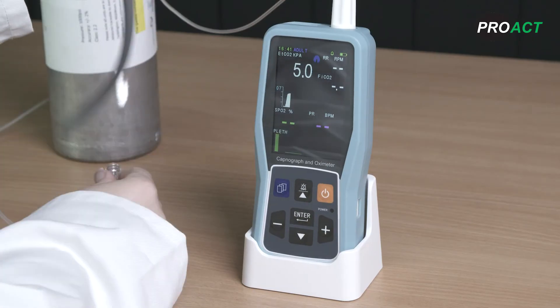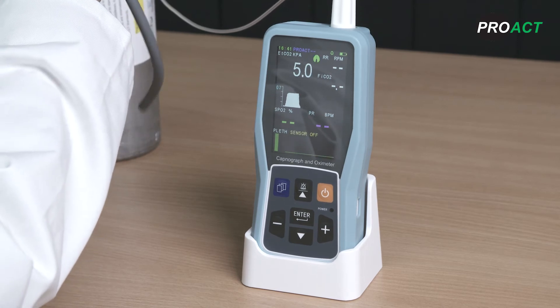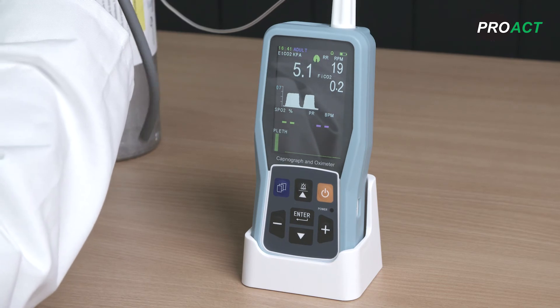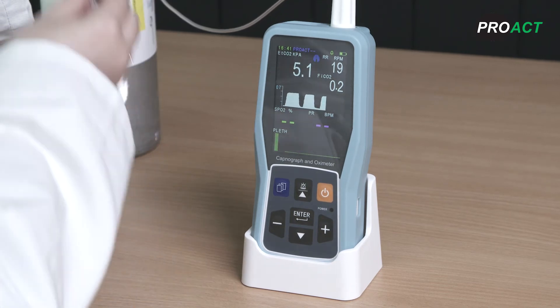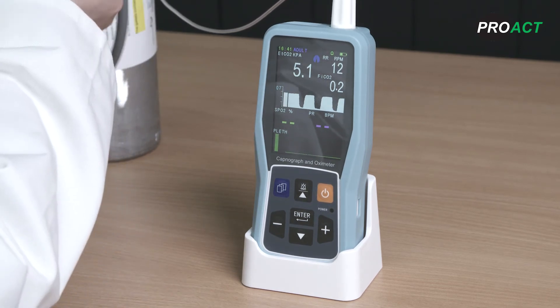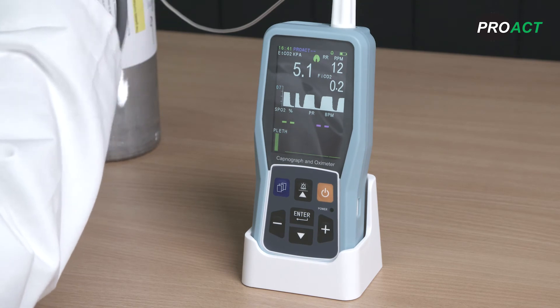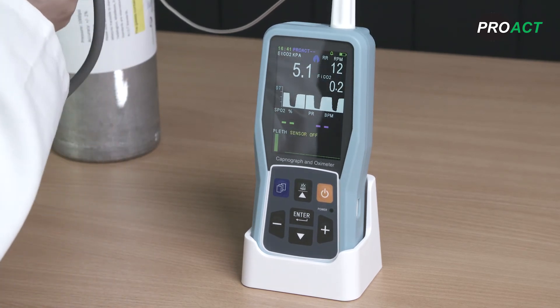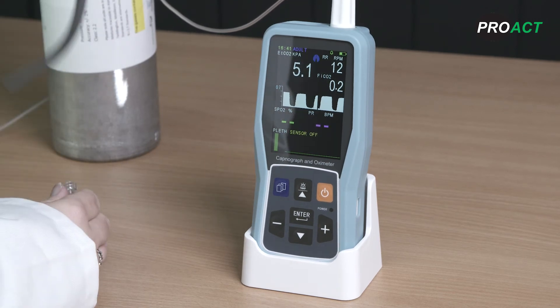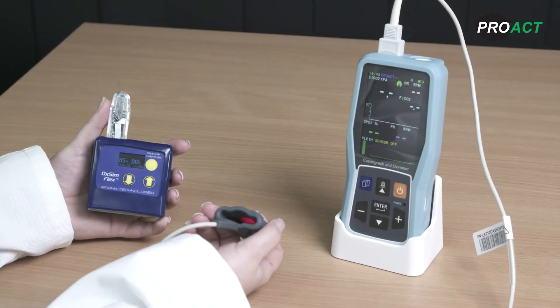Your device should read 5% CO2 plus or minus 0.2. Switch off your calibration gas flow. Should the PC-900B not calibrate correctly, repeat the procedure after checking that the gas canister isn't becoming empty. If so, use a new canister and repeat the procedure. If the device is still not calibrating, please contact Proact Customer Services on returns at proactmedical.co.uk or call 01536 461 981 for advice and return repair information.